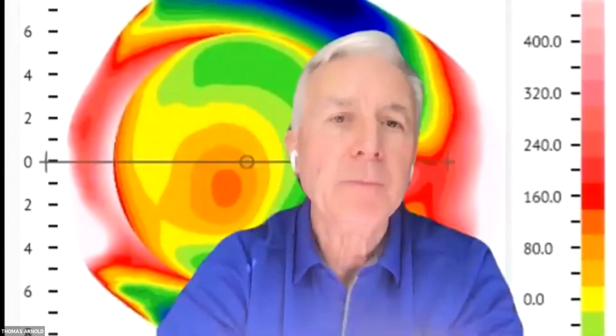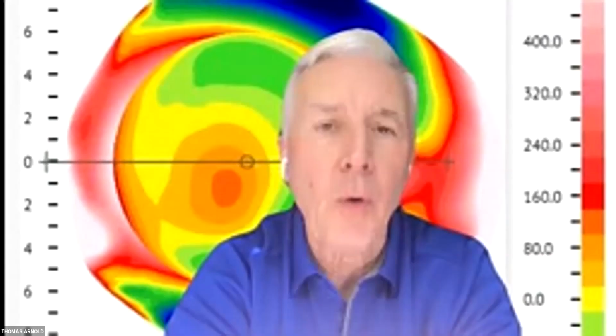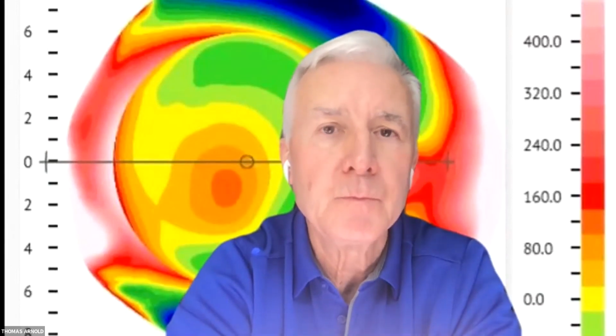I'm thinking also about the Blanchard lens. If you use the Fit, I can't remember if they call it Fit Connect on their platform or whatever, but when you transfer the data over, they've got a button that you can hit that says like manual entry or manual data or something. Right. When you hit that, it'll give you an angle. It'll say like 46 degrees or 42 and a half degrees or something. Is that angle coming from the tangent angle?